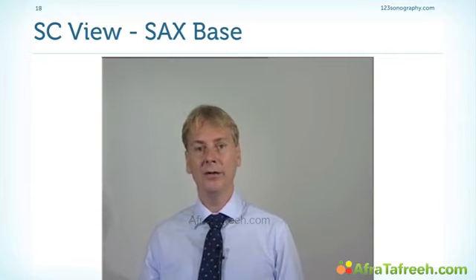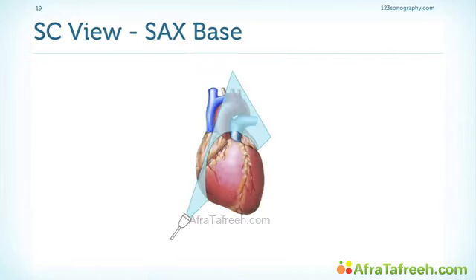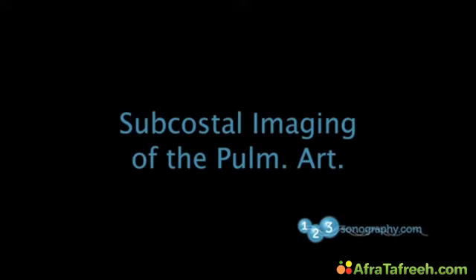the base of the heart, now from a subcostal approach. In general, this view is not much different than the view that you get from the parasternal window. The only difference is that now you're imaging the patient from the bottom, while from the parasternal view, you would image the patient from this side. So the views are the same, they're only from a different transducer position. But in both instances, you would image the base of the heart where you transect the big vessel.